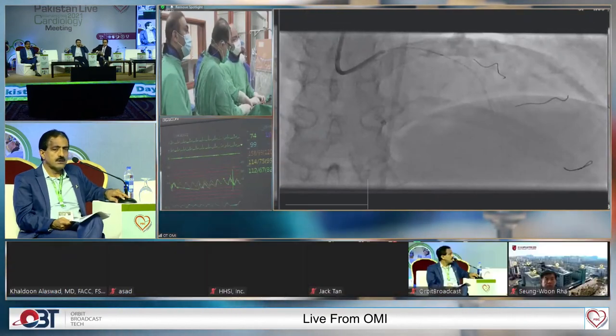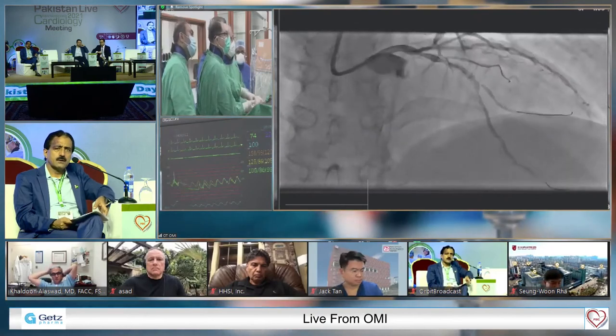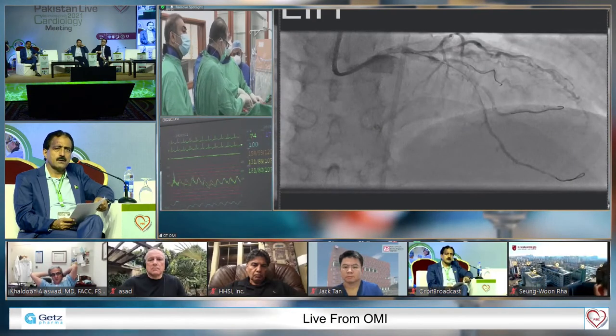So we've got the wire across, we checked it. There are balloons. We ballooned the CTO. There's a lot of calcium. And this is what we got right now.